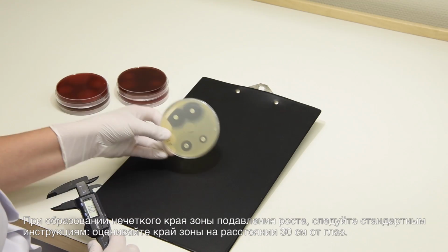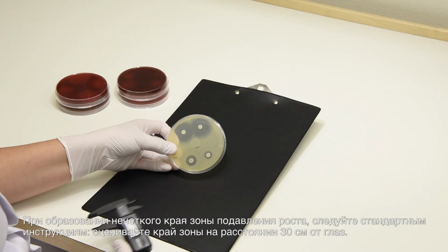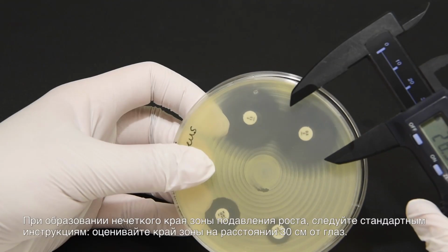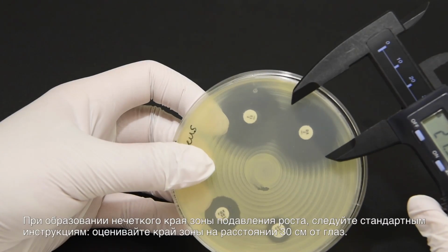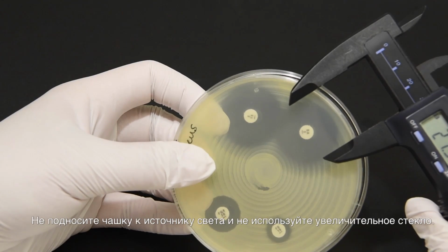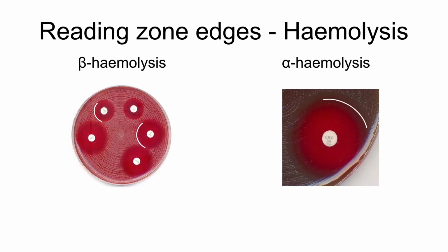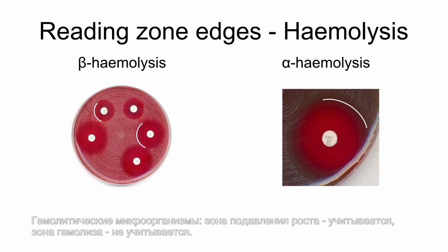If zone edges are fuzzy, follow the standard instructions, namely, hold the plate about 30 cm from the eye and estimate the zone edge. Do not hold the plate up to the light and do not use a magnifying glass. For Proteus species, ignore swarming when reading inhibition zone diameters. For hemolytic organisms, read inhibition of growth and not inhibition of hemolysis.